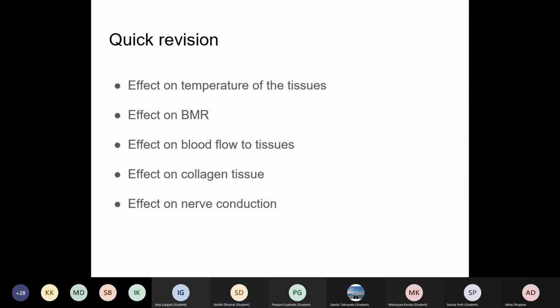Now overall relaxation has occurred. Overall all these muscles are relaxed now, the spasm has relieved. So therefore you are going to get a nice sedative effect over here.